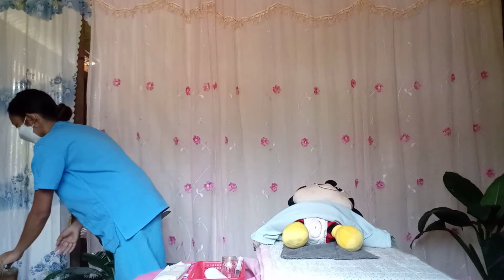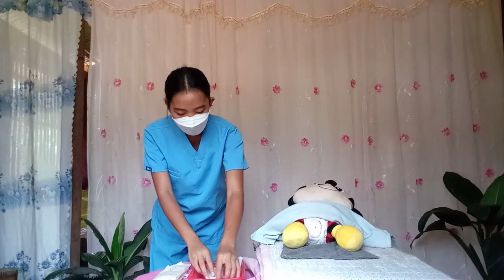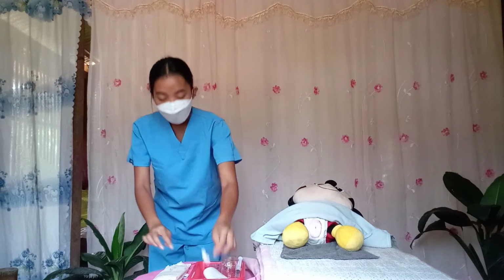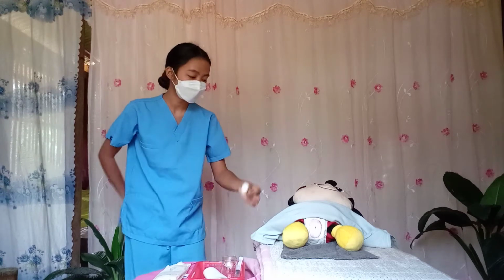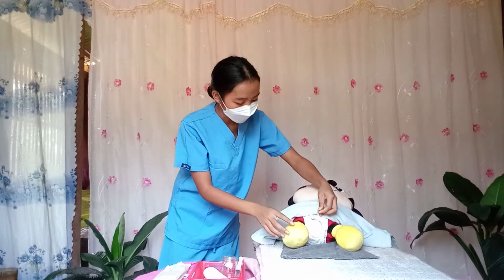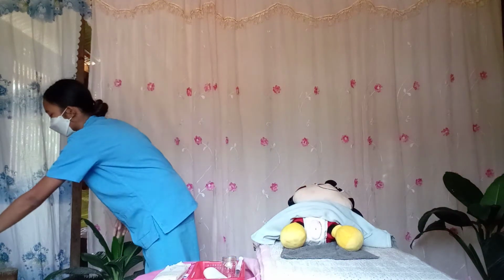Okay, the next thing that we are going to do is use this forceps to pick a cotton ball, soak it with a cleansing solution, and then wipe downward, then discard.